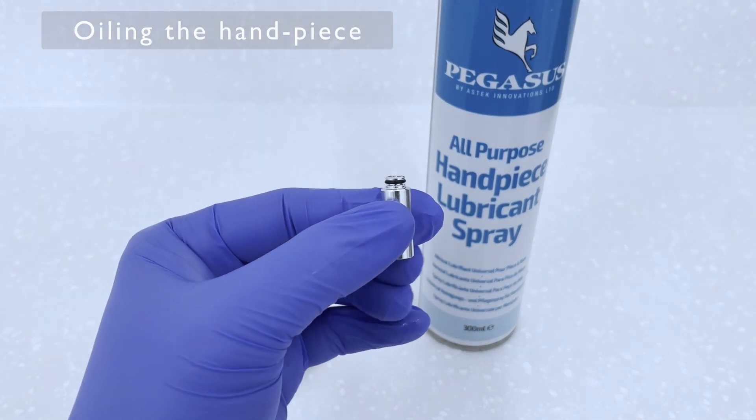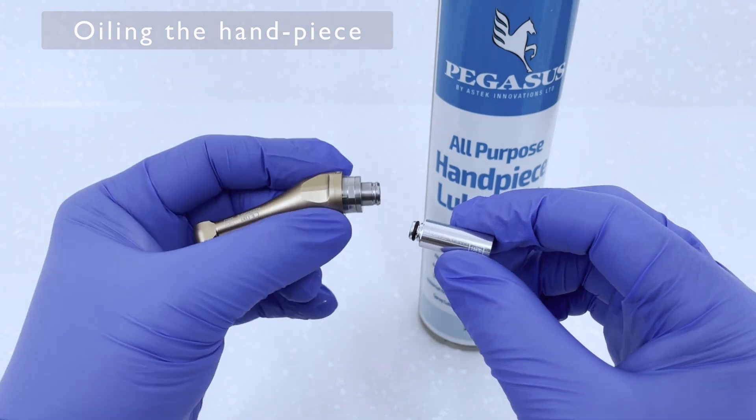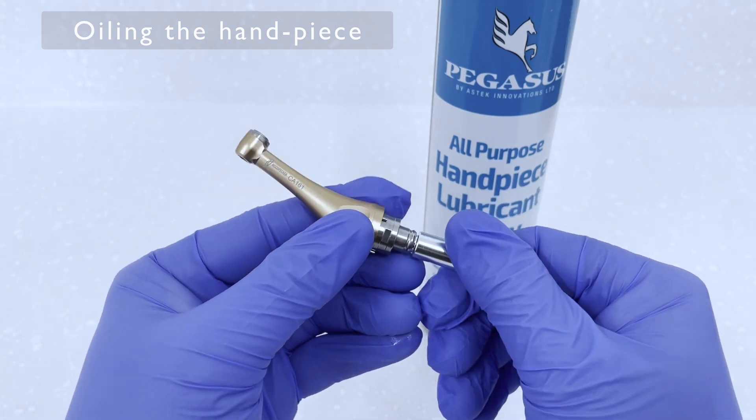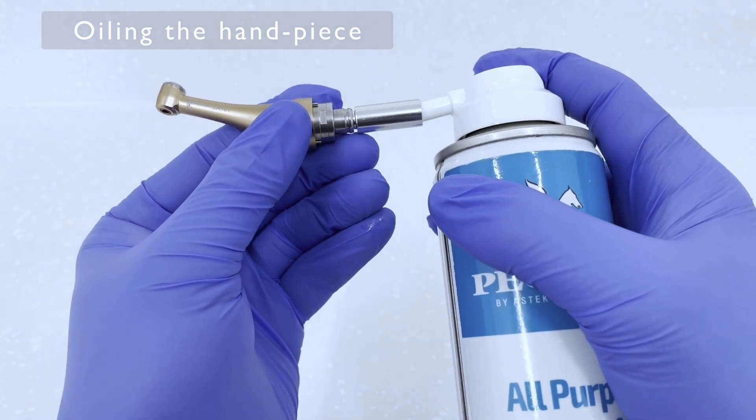Oiling the handpiece is pretty straightforward. There is an adapter that comes with a removable head that connects to a can of oil, if of course you don't have a specific machine to plug the handpiece into.